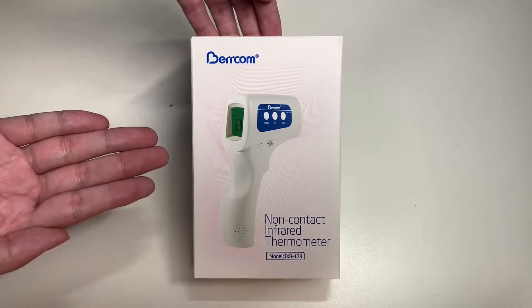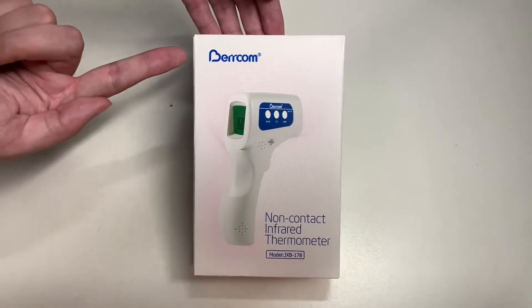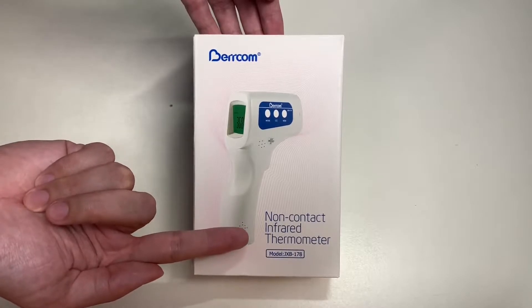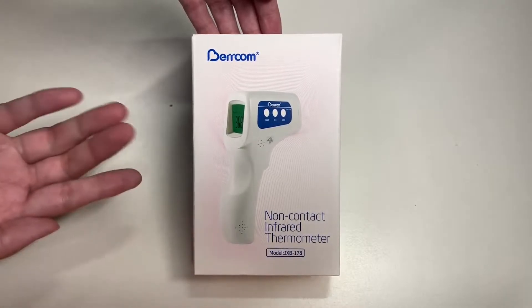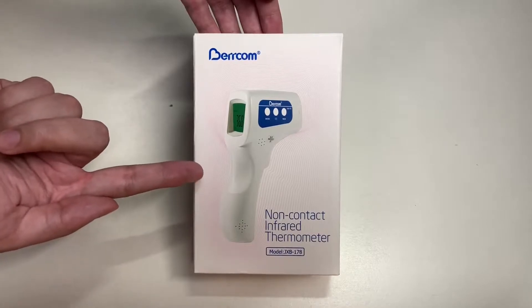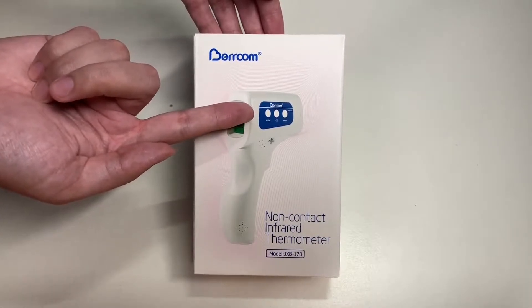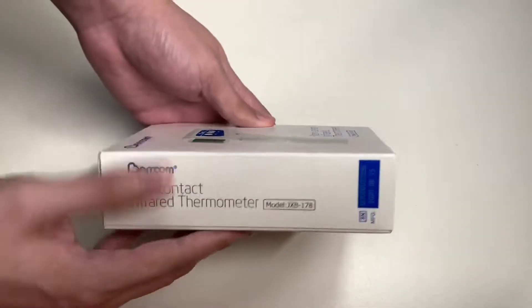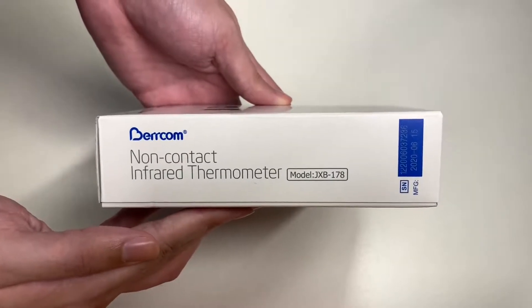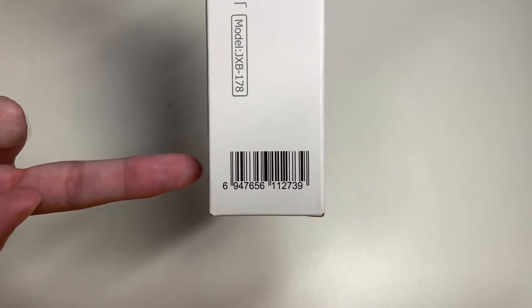Before we do, let's go ahead and take a look around the box. Here's the Berrcom non-contact infrared thermometer and here's the model number. The thermometer looks like a gun with a radar, kind of like a speed gun. You have the trigger, buttons, and a screen that tells the temperature. Here are the sides of the box, and here's the barcode and serial number if you want to look this up online.